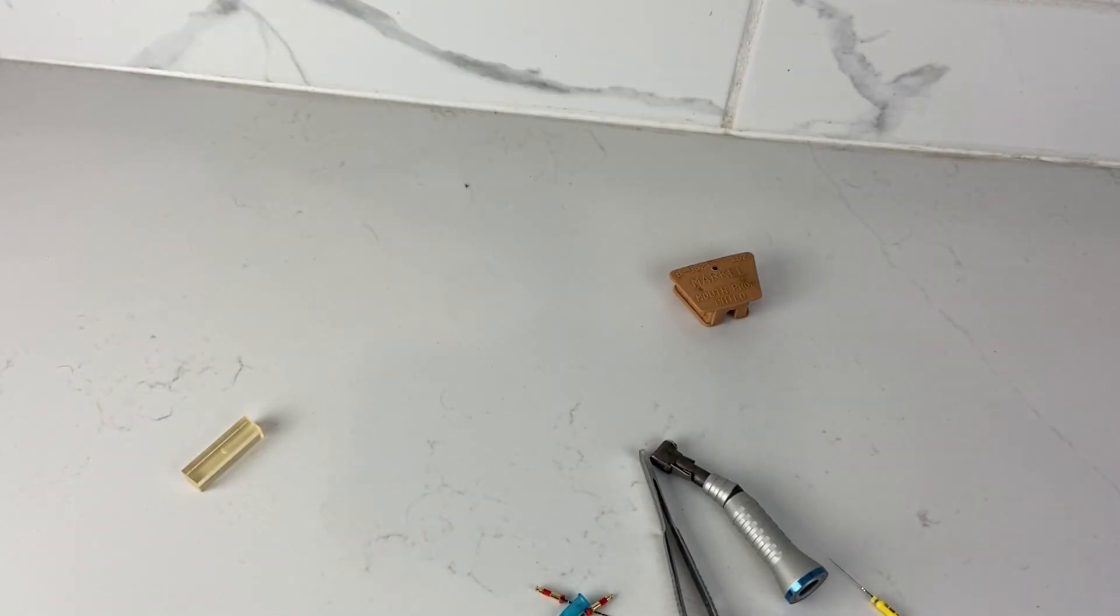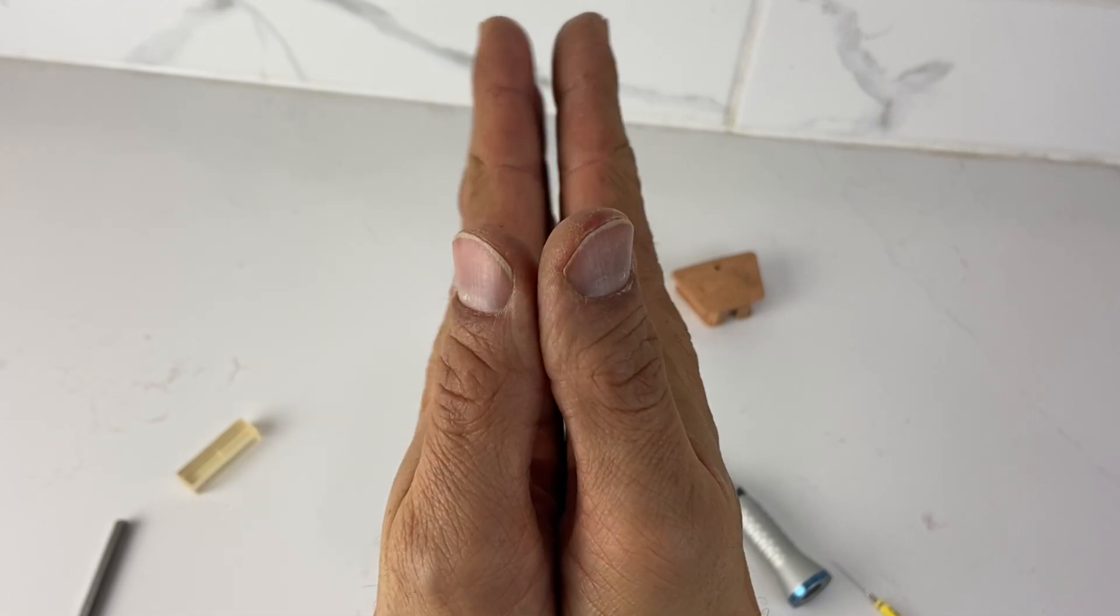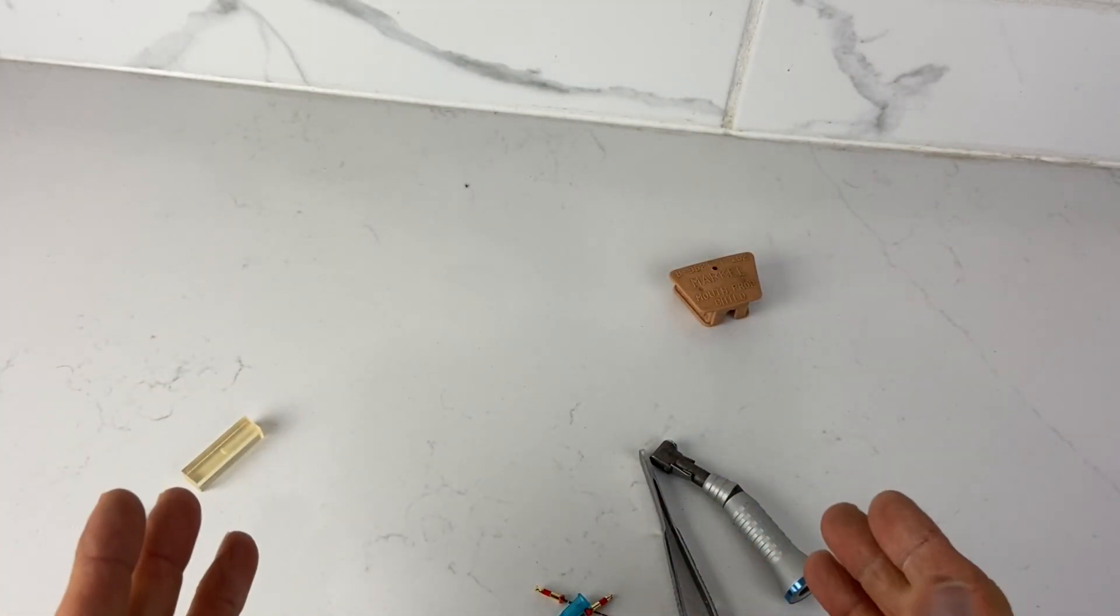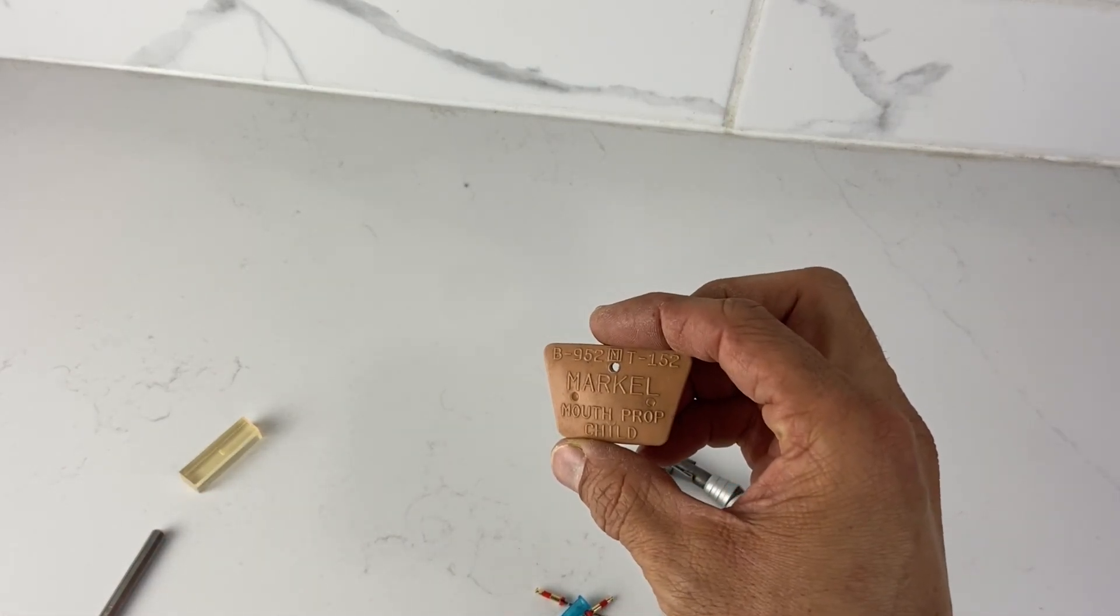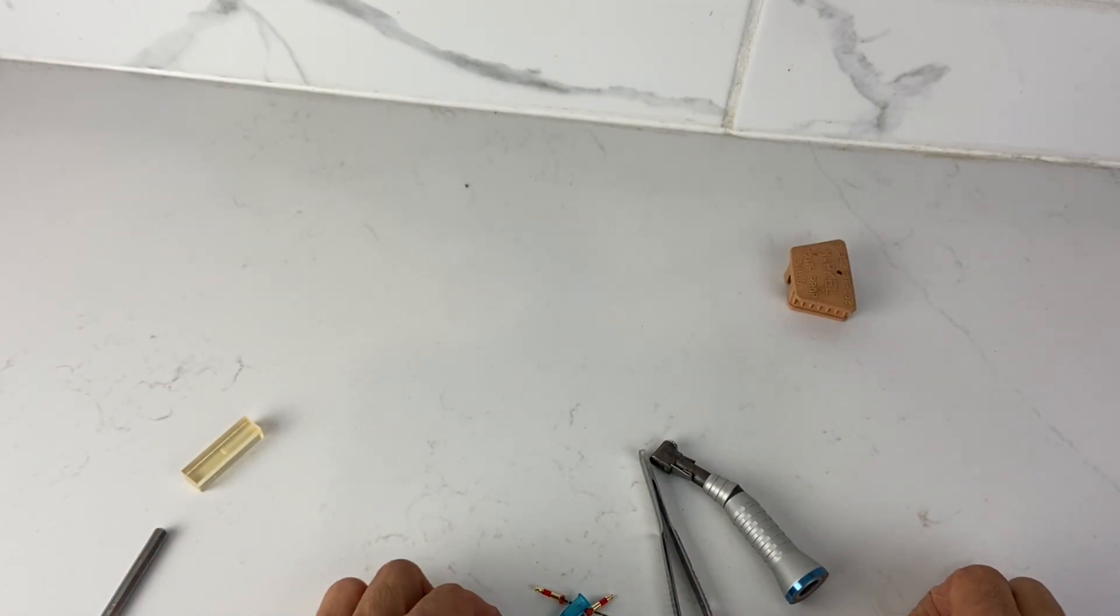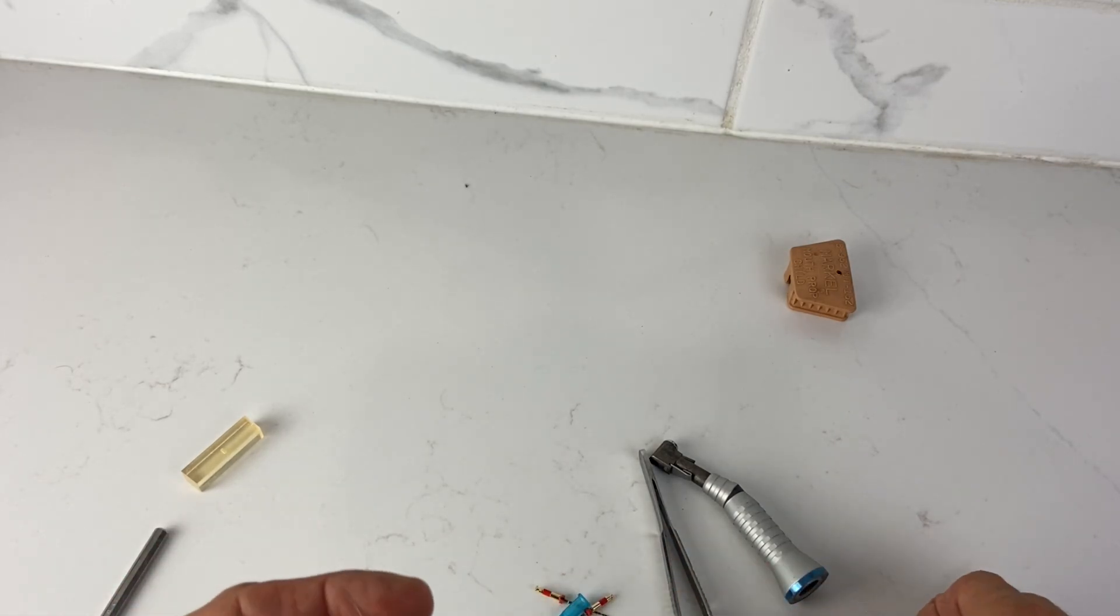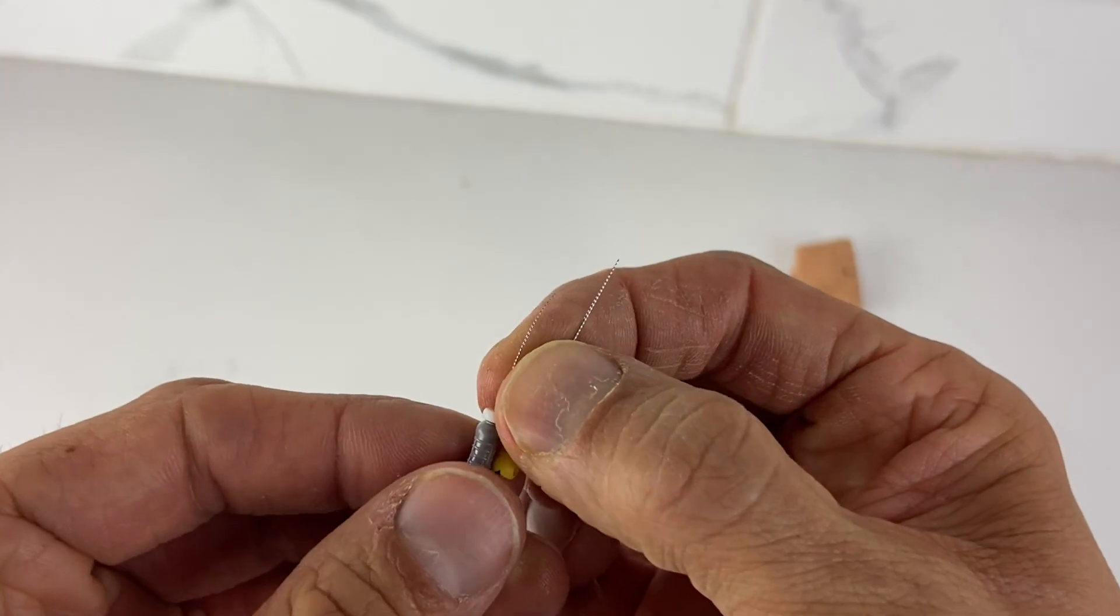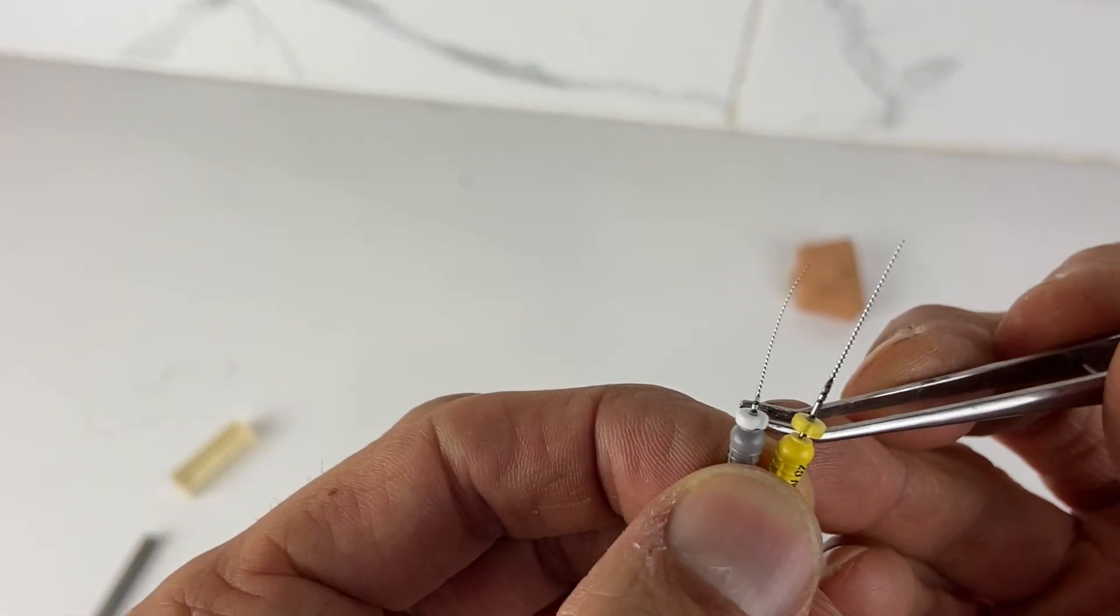So the question is trying to do an endo on somebody who cannot open very wide. If this is normal opening, they can only open this much. I'm doing this at home. I just want to go over some of the tips. I have the basic stuff. The first one I'm going to do is I'll use a bite block every time. Every case gets a bite block unless they don't want it.